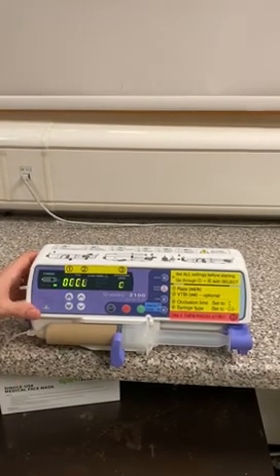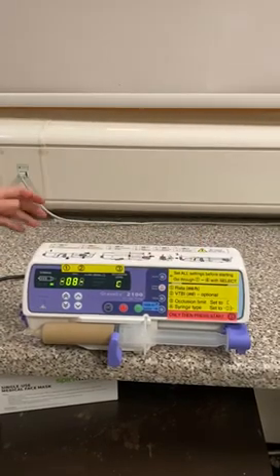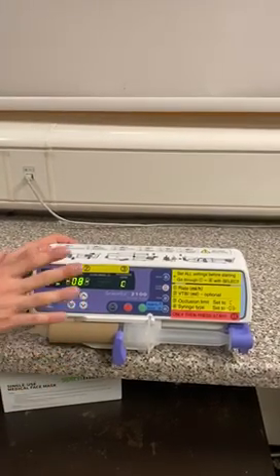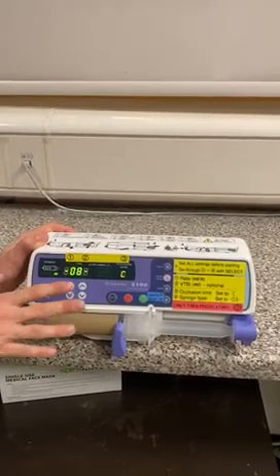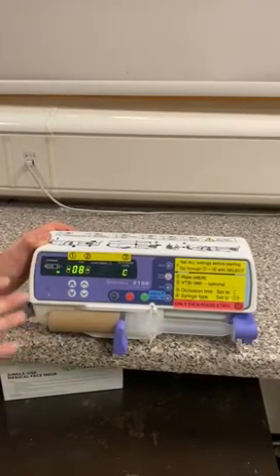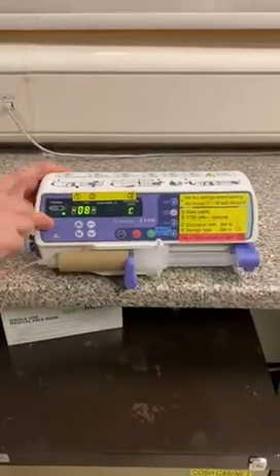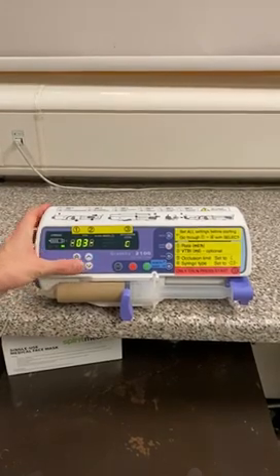The fourth and final thing we need to set — by pressing select one more time — is the type of syringe. This is really important because our normal pumps know exactly what type of syringe we're using. We have to tell this pump because it can't work it out for itself, and if you get it wrong it will give the drug at the wrong rate. This is a BD PlastiPak syringe, and the number for a BD PlastiPak syringe is 03 — you can look that up on the top of the pump. We need to set this to 03 using the arrow keys until it says three.